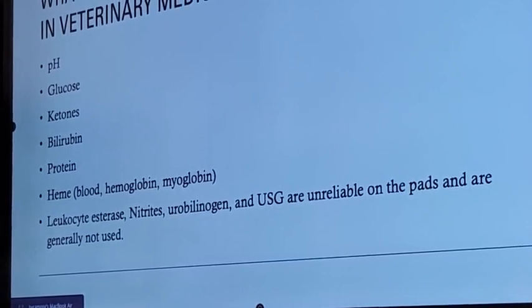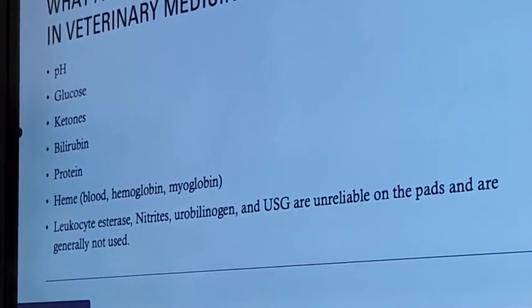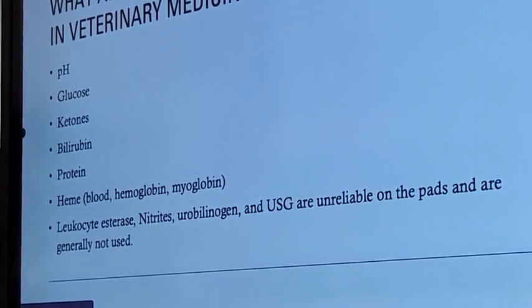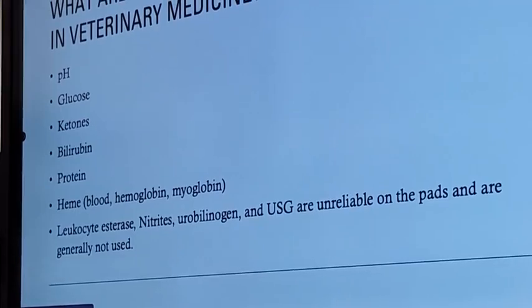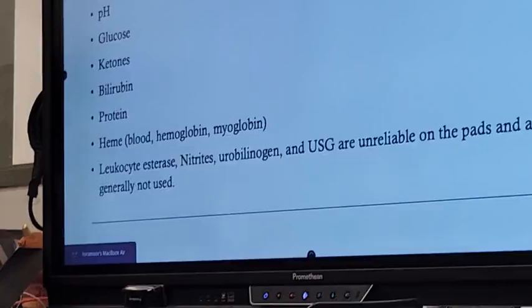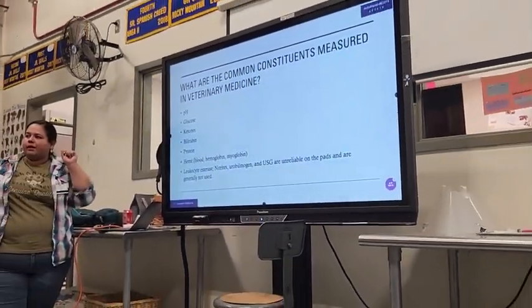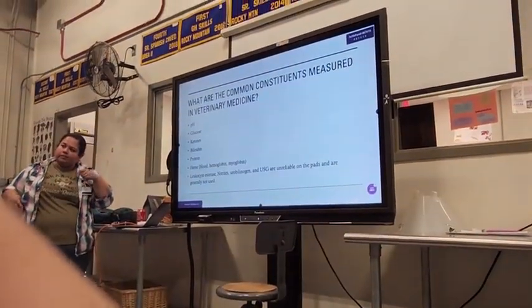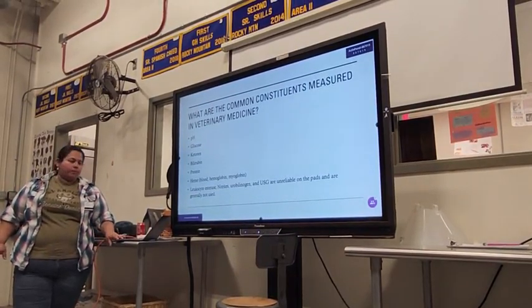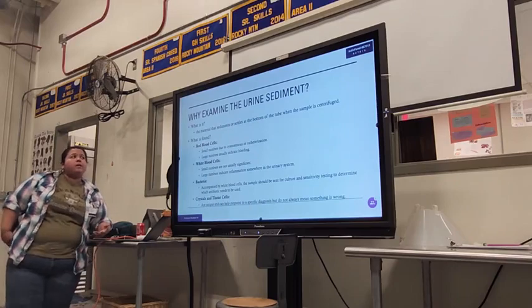I mean, obviously, you're not going to be splashing it about either, right? You're going to be as careful as you can. So, unfortunately, yeah, you're going to have to write down your test results, because you're not going to take off your glove. I mean, you could stay ungloved with one hand if it's your dominant hand, but are you going to have enough control with your non-dominant hand to perform the test? Does that make sense? It's all about comfort level. It's really how you perform, so keep that in mind. Okay? Great question.